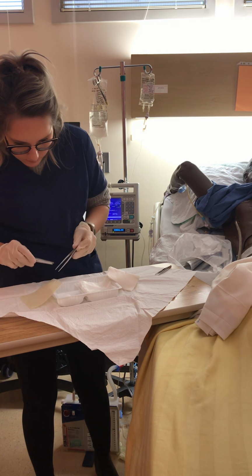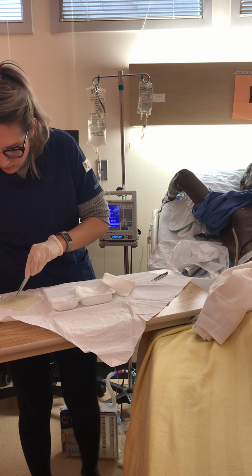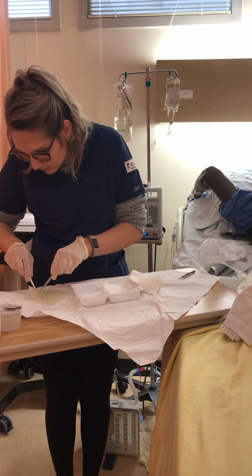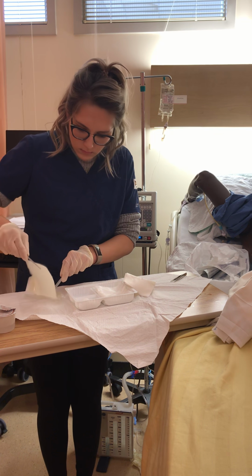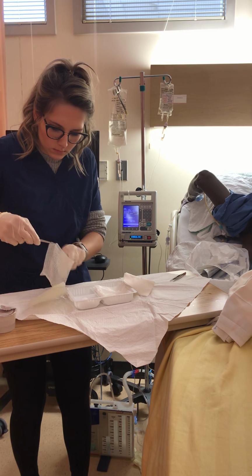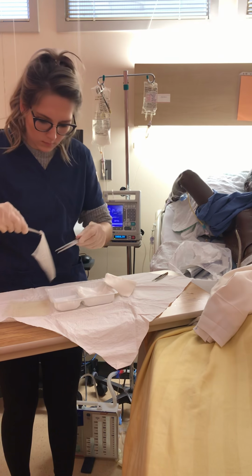In reality, the chest tube would not move out of place. Making sure everything is sterile. One more. It's completely dry. And then I will do one more just down the length of the tubing, staying within that 1 inch border.